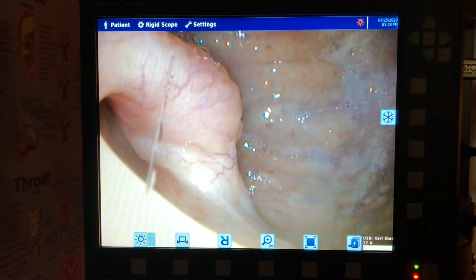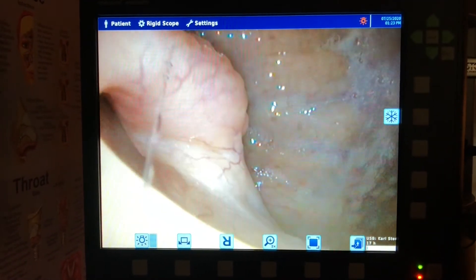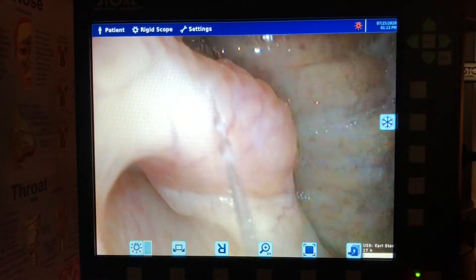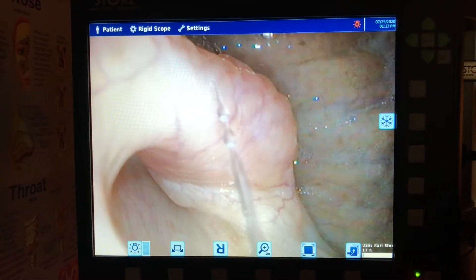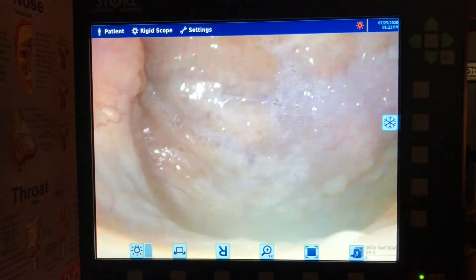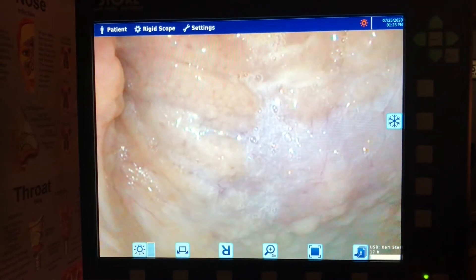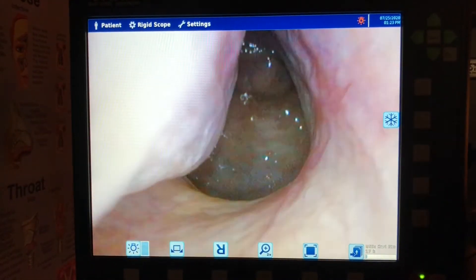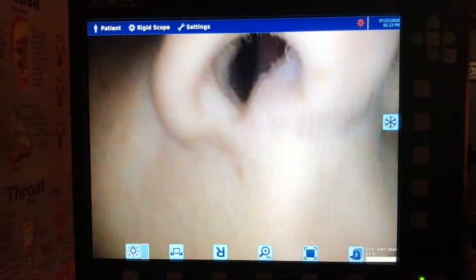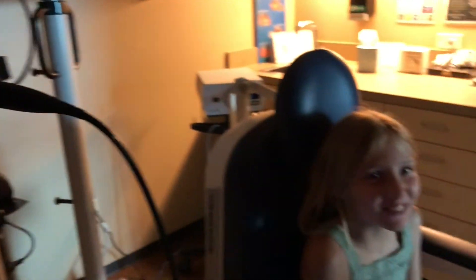We've talked about the eustachian tube a lot in the past, but that little opening right there goes up to the eustachian tube. This is a 10-year-old patient who's tolerating this scope very well because she's been told if she doesn't she'll get no dessert. No — not true.